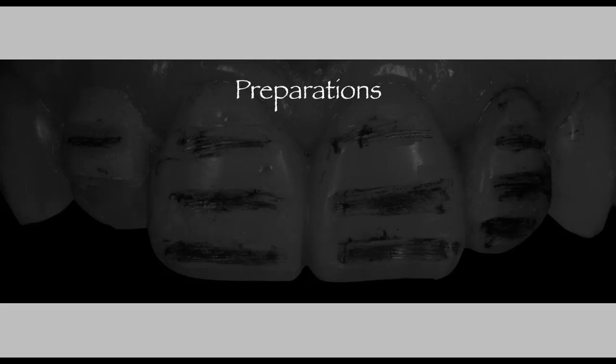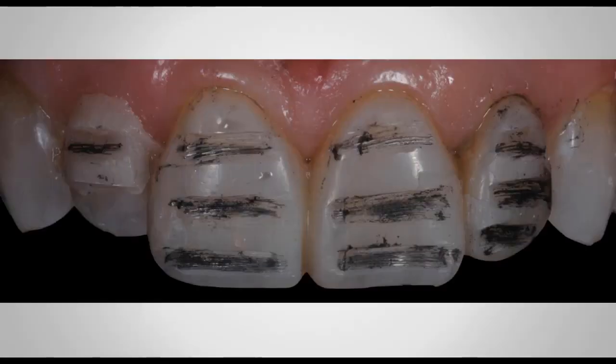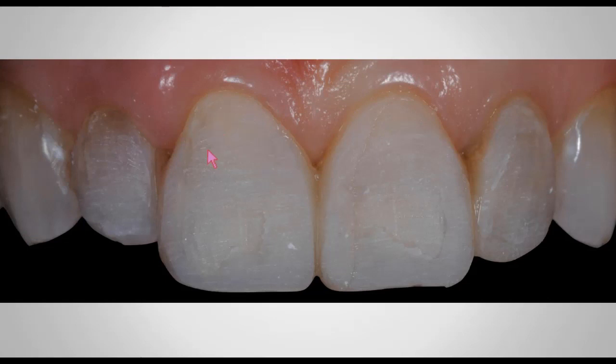So now we're going to go into the preparation. So how can the bonded functional aesthetic prototype help me with my preparations? And again, you see, I'm going to use my depth cutting burrs directly through the prototype, and now I'm going to make all these lines come together. And you can see right here, the prototype is still in place. I've only removed the facial aspect, make all those 3 lines come together.